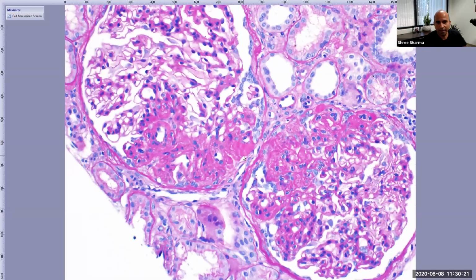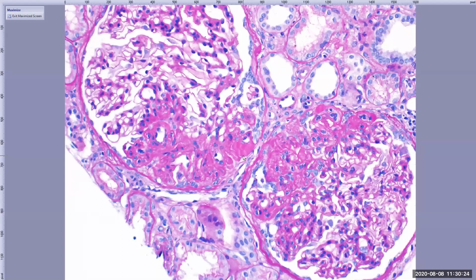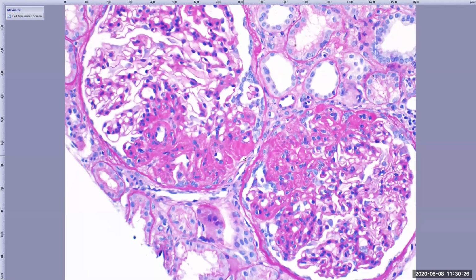Man, what do you call that, hyaline? That's what we're trying to do. We're trying to be very, you know, like, is it because it's pinkish right there? For everyone on the call, we want to try to bring it down to the level of a first-year fellow. I agree with you.